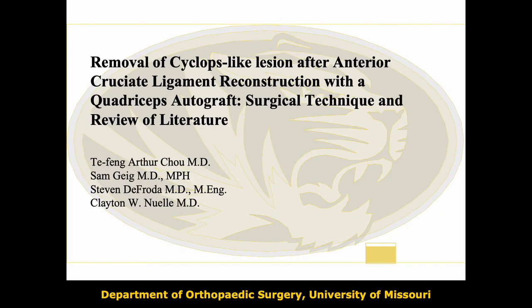The following video demonstrates the removal of Cyclops-like lesion after ACL reconstruction with a quadriceps autograft.